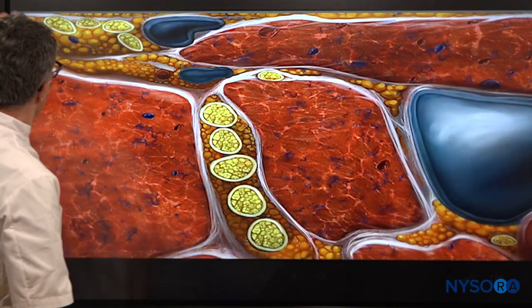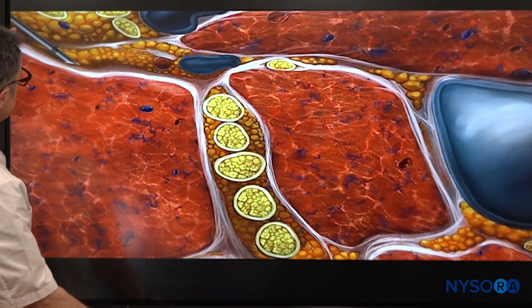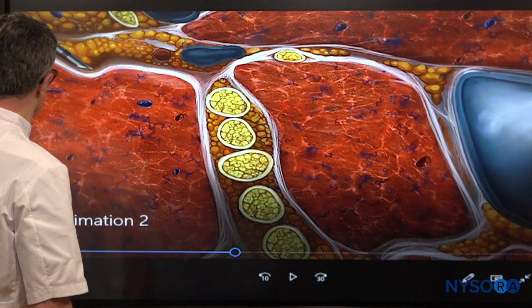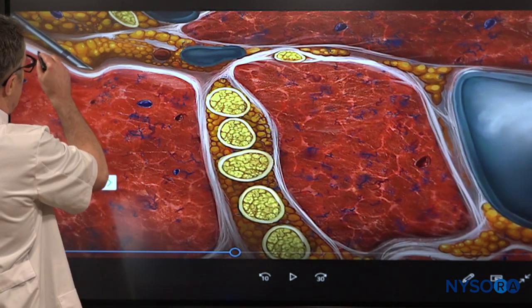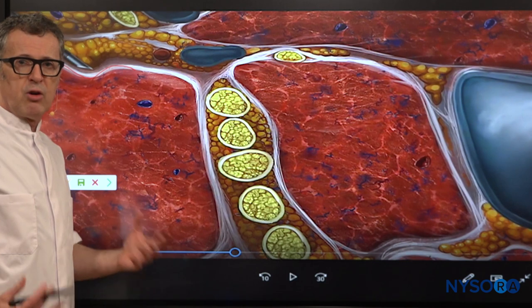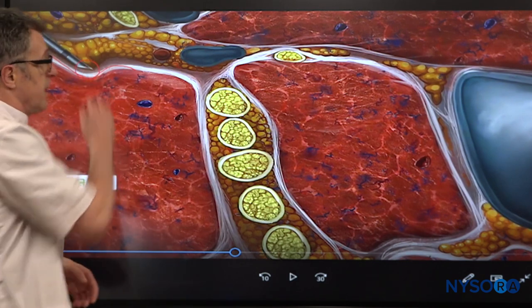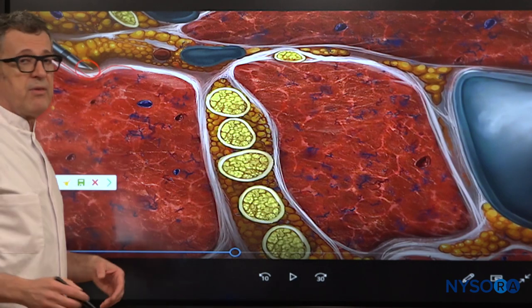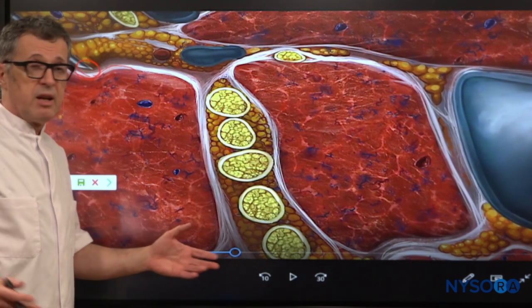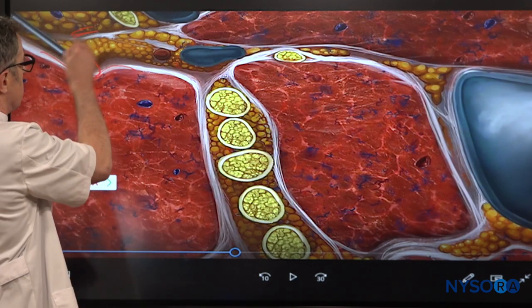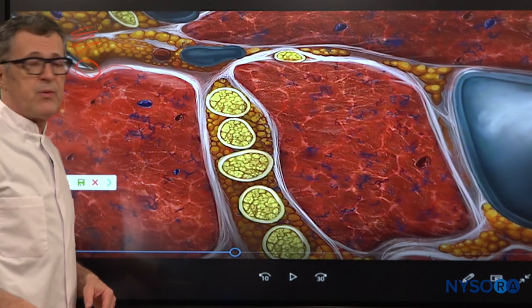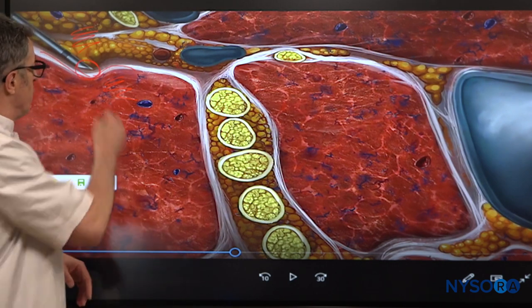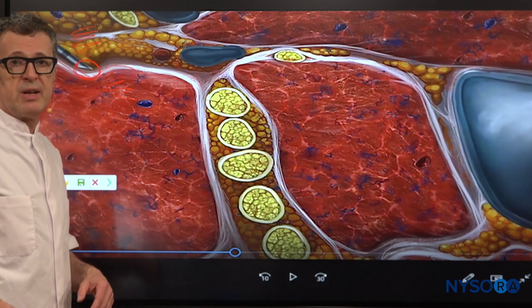As we now watch the needle pass into the tissue, you can see how the needle engages the cervical fascia. Fascia layers are tough — the needle always has to fight them. As the needle pushes to penetrate the fascia, eventually the fascia gives in. The fascia is typically tougher than the tissue before or after it. For that reason, when you penetrate the fascia, two things happen.